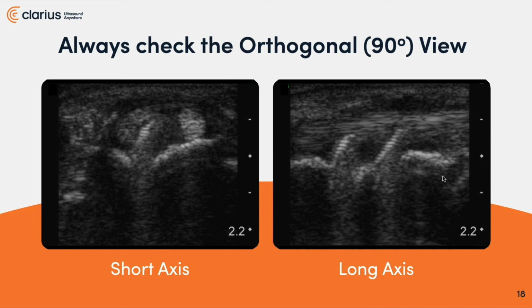This again is the distal radius, and coming up through the distal radius were 2 metal structures. And you can actually see the threading on these screws. You can see the fluid accumulation of inflammation, where clearly it was painful that she couldn't move this, because should she have actively extended her wrist, it would have bifurcated or at least torn through those tendons. This particular individual would have been shamed into trying to get movement. Ultimately, I did talk to the orthopedist, and they removed the hardware, and sadly enough, I didn't get to visit with her for too long because she improved so well she didn't need a lot of my help.